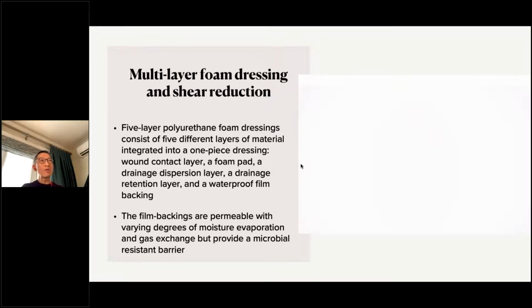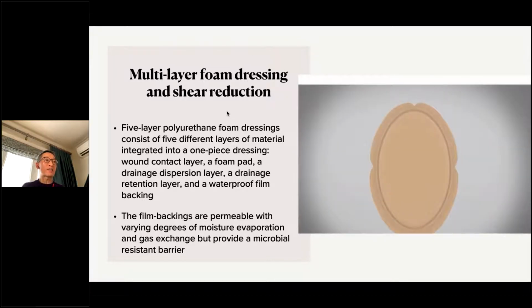And the most important part about the application of foam dressing to address pressure injury in the NPI-AAP guideline is very clear. It's not about every different type of foam dressing. It's about the multi-layer foam dressing that has the best evidence to support its use in clinical practice. So most of the foam dressings, multi-layer foam dressings, are very similar.